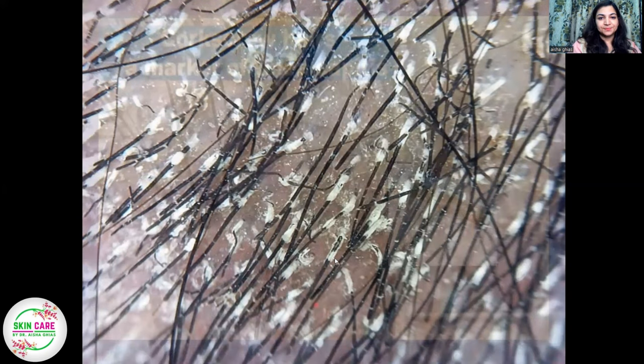This was an ectothrix type of tinea capitis. The spores have surrounded the hair shaft from all the sides to give it a false appearance of whitish hair. See this hair. The caliber of the hair is thinner, but because of this sleeve-like sheet of ectospores all around the shaft of the hair, it seems as if something is wrapping up this hair. So this was an ectothrix type of tinea capitis.